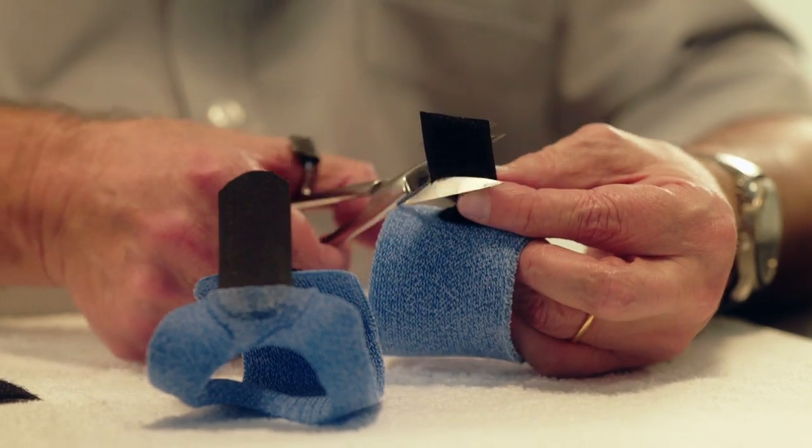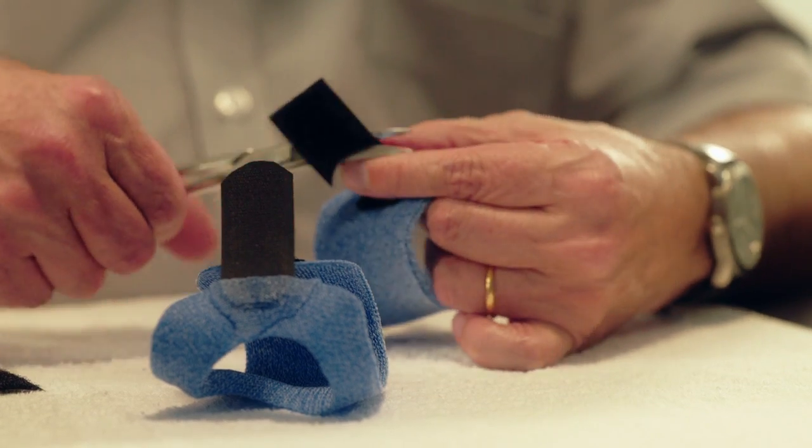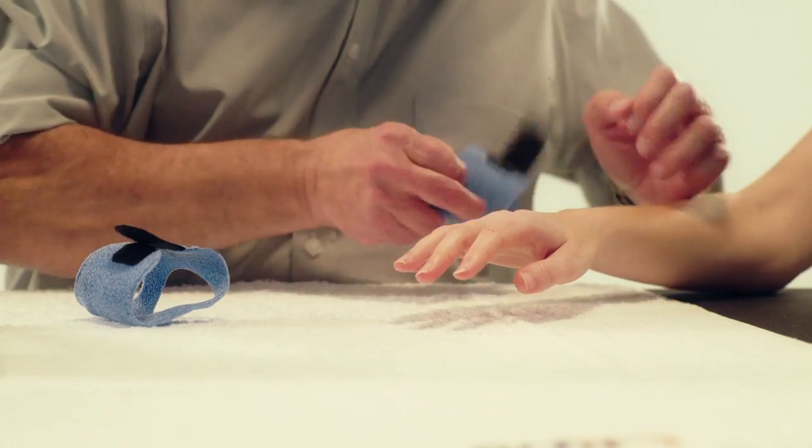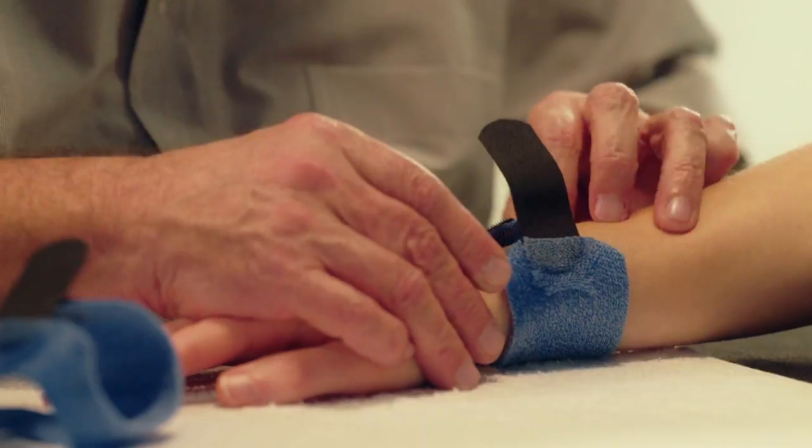Round the corners of the straps. Put both portions of the orthosis on the patient.